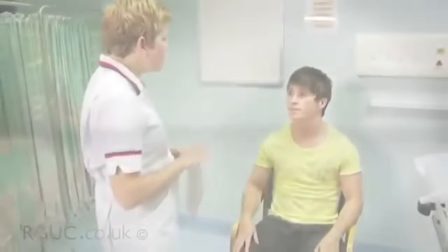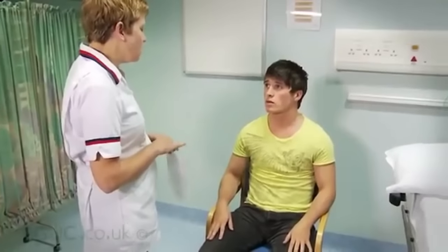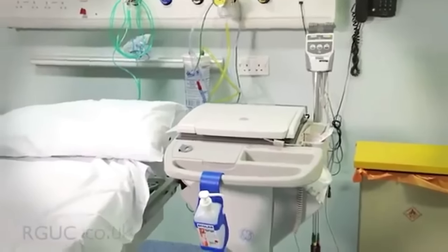If you're performing an inpatient ECG, then also check the patient's wristband to verify their patient identification number. Cross-check the patient's details with the request form. Check whether the patient requires a chaperone or interpreter to support them. Before commencing the test, briefly explain the procedure to the patient and gain informed consent verbally.